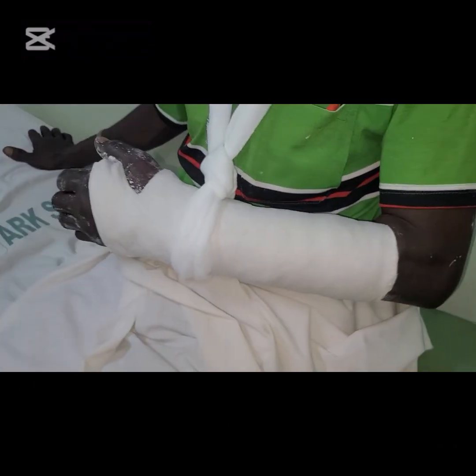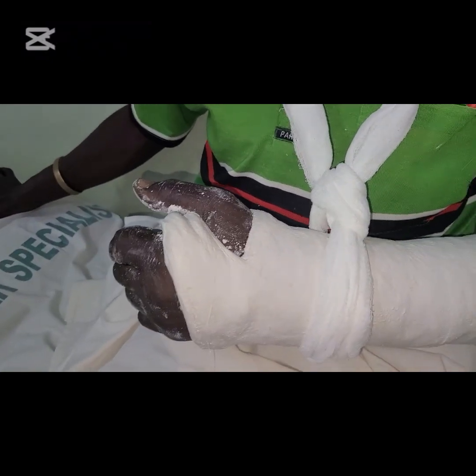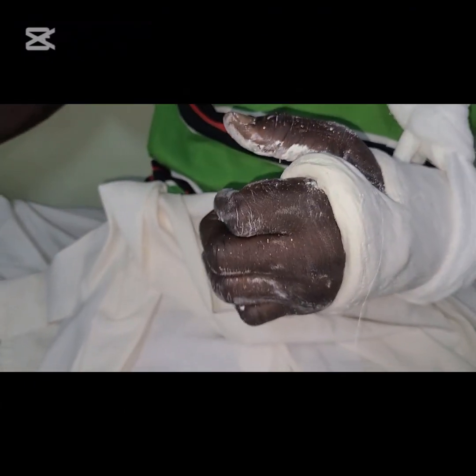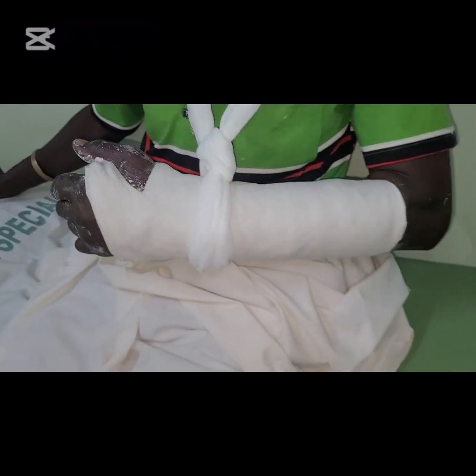We use this ordinary POP cast, but there are other types of casts which are a bit modern. For example, this fiberglass, which is light and classy.